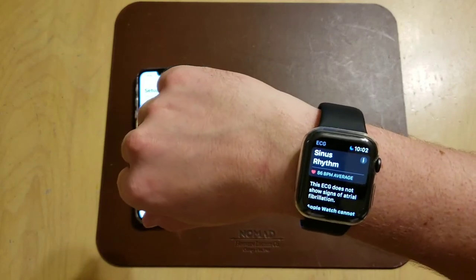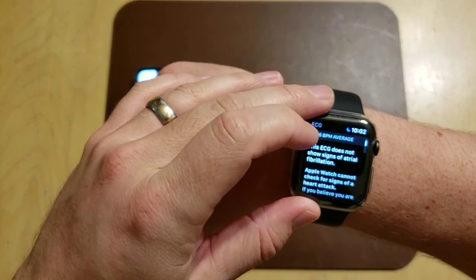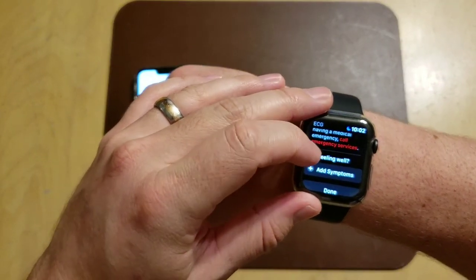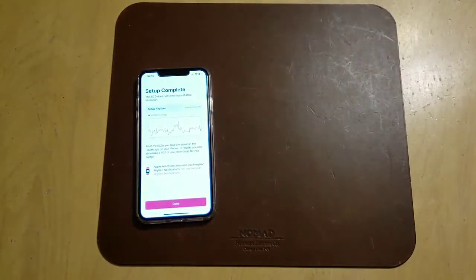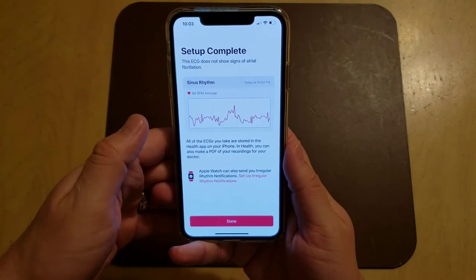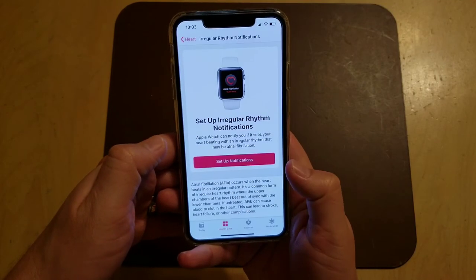It says I've got a sinus rhythm at 86 beats per minute average right now, and the ECG does not show any signs of atrial fibrillation. You can even add symptoms down there. And that's how you do an ECG — that's how you get everything set up. Setup is complete, and you can also set up your irregular rhythm notifications.